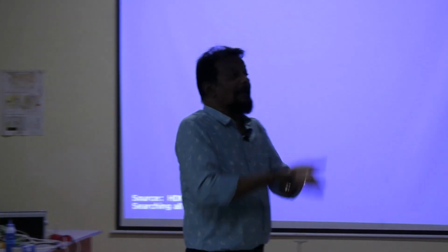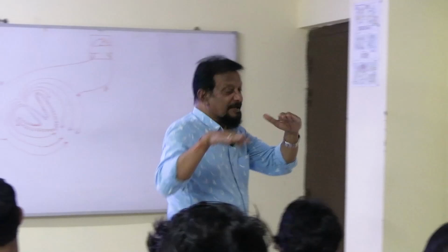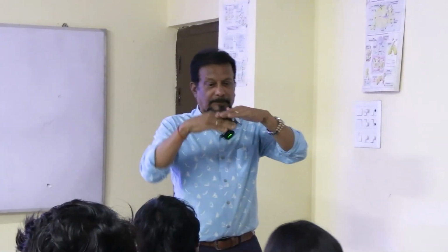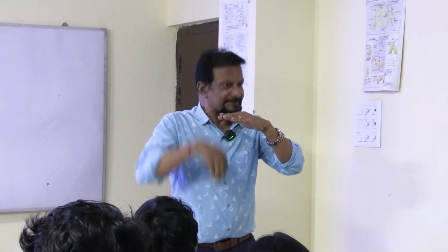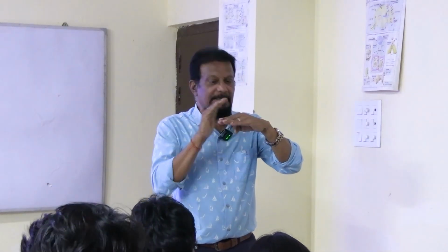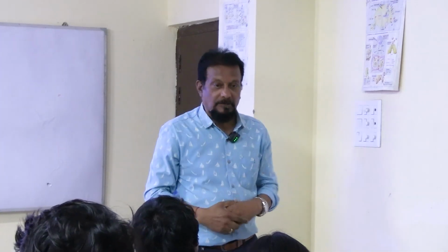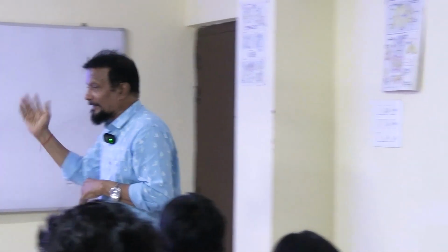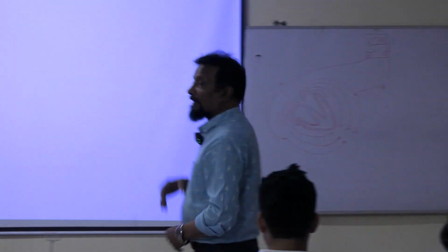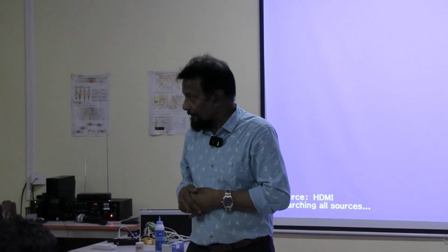There may be elevation from baseline. This depression means in respect of the baseline, the ST segment is below the baseline. That is, it is depressed. It may go up above the baseline. It is called ST segment elevation. So there are different pathologies. We will explain in the next day what the causes are, what conditions we can see where we will get the ST elevation.